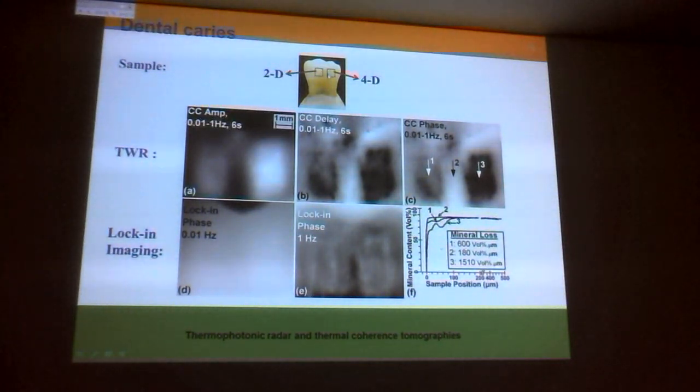You can be essentially transparent, but you say, why don't I use that? Because then you lose resolution and contrast. You don't see the caries effect. All you see is the big features, that is, the enamel and then the dentin. So it's a happy medium between 800 to 900 to 1000 nanometers at most. I think that's what I would use in order to see these features. Otherwise, it would just be washed out.